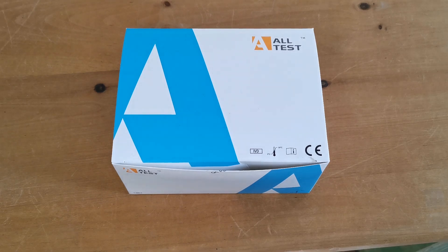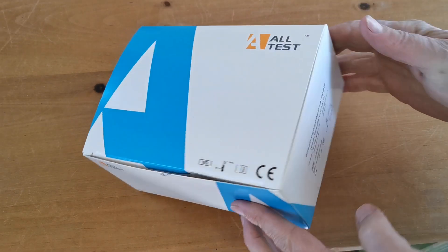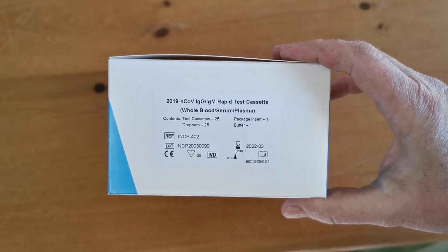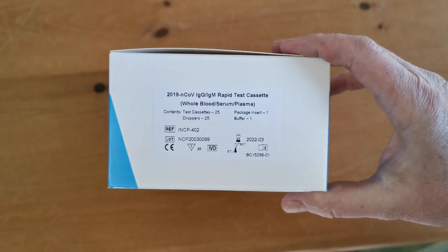Welcome to this presentation video where we're going to run you through the procedure and interpretation of results for this coronavirus all-test rapid 2019 NCOV IgG IgM test. This is the pack that all tests have produced. We show you the catalogue reference on the back — it's a 2019 NCOV IgG IgM rapid test cassette for whole blood, serum, and plasma samples.